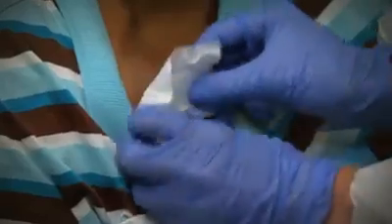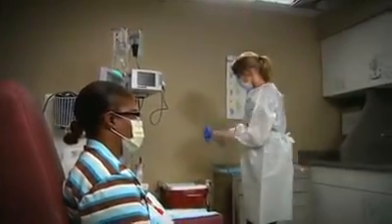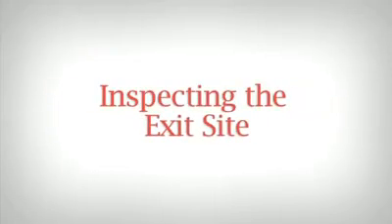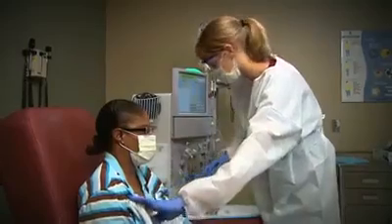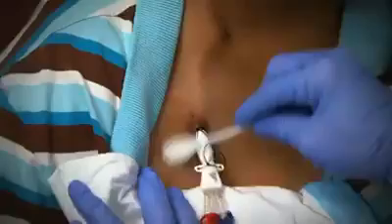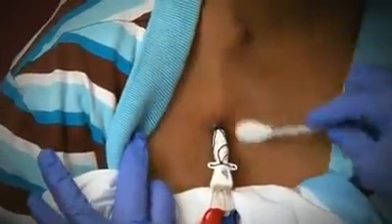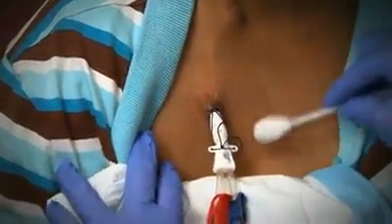Remove the old dressing and discard it in an appropriate infectious waste receptacle. Once you've done this, remove your gloves and perform hand hygiene. Put on clean gloves and inspect the exit site and tunnel for redness, heat, swelling, tenderness, or pus or other discharge. Then cleanse the area with an antiseptic solution like chlorhexidine by using an outward circular pattern. Start at the exit site and move outward in a circular pattern.